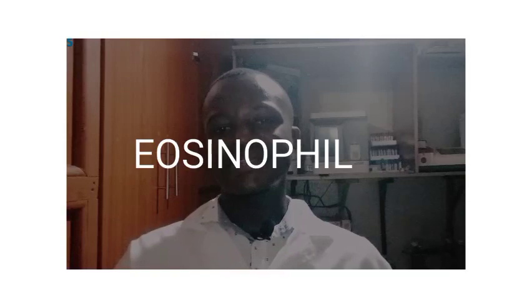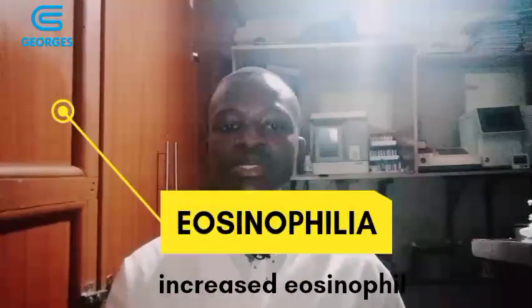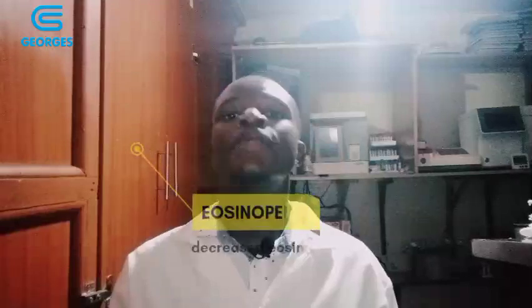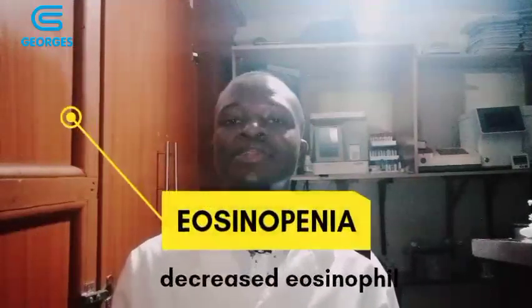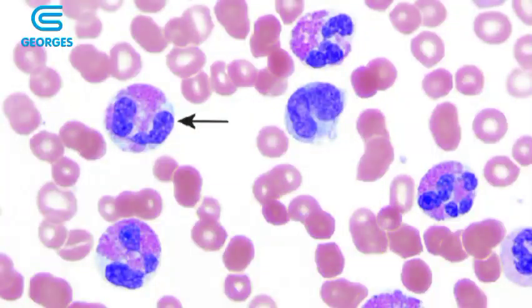The next type of WBC is the eosinophil. Eosinophilia is an increased eosinophil count, and this can be common in parasitic infections and during allergies. Maybe you have an allergic condition or a hypersensitivity reaction. Aspergillosis can lead to eosinophilia, and eosinopenia is a condition whereby there is a decrease in the number of eosinophils, and this can be common in a situation whereby there is sepsis. So that is a picture of an eosinophil. As you can see, that's how an eosinophil looks.